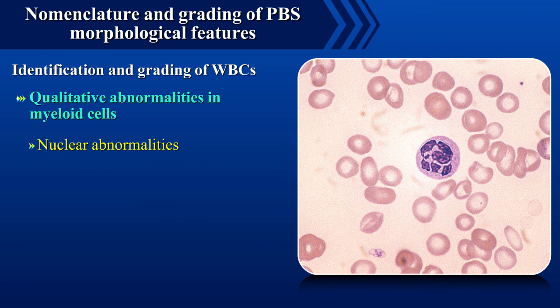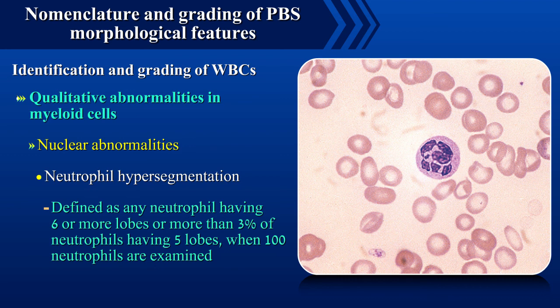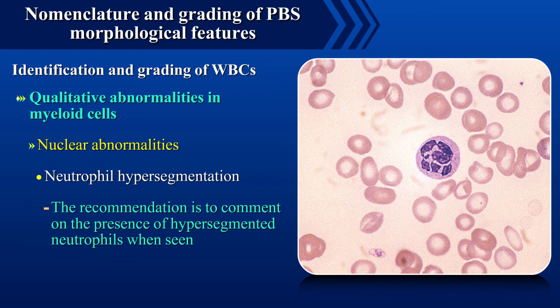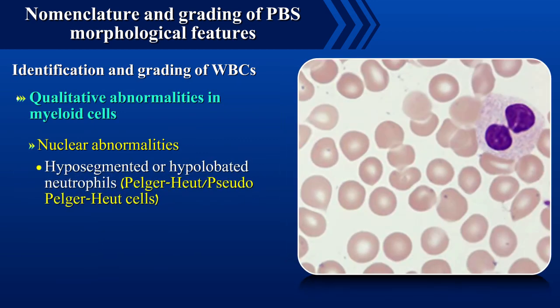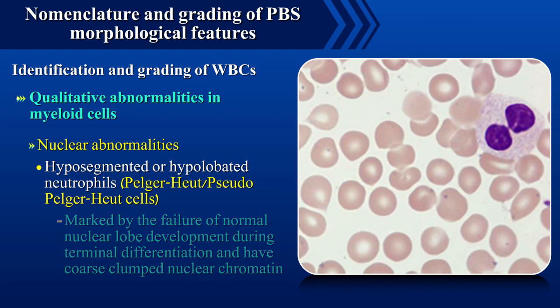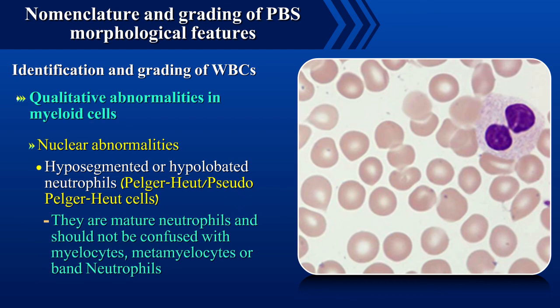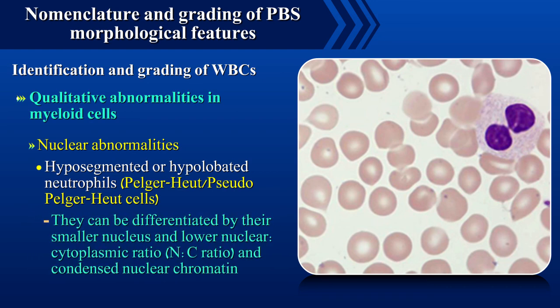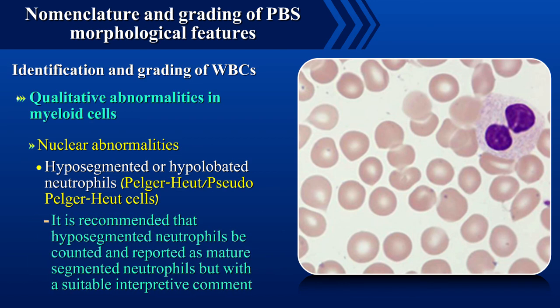Coming to nuclear abnormalities: neutrophil hypersegmentation is defined as any neutrophil having 6 or more lobes, or more than 3% of neutrophils having 5 lobes when 100 neutrophils are examined. The recommendation is to comment on the presence of hypersegmented neutrophils when seen. Hyposegmented or hypolobated neutrophils are marked by failure of normal nuclear lobe development during terminal differentiation and have coarse clumped nuclear chromatin. They should not be confused with myelocytes, metamyelocytes or band neutrophils, and it is recommended they be counted and reported as mature segmented neutrophils with a suitable interpretive comment.